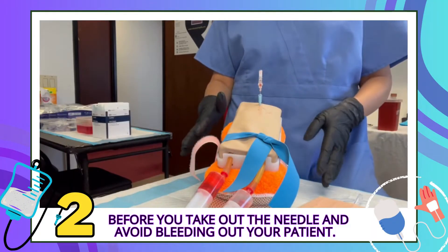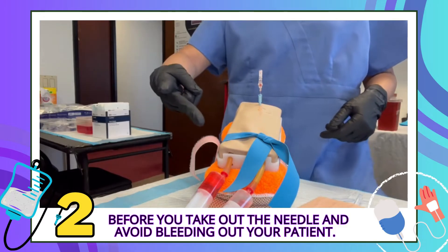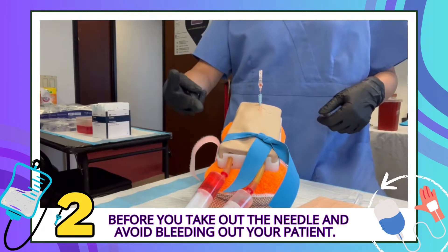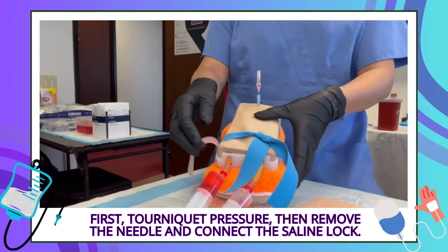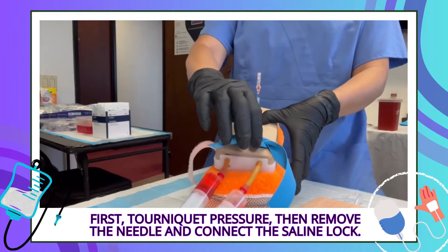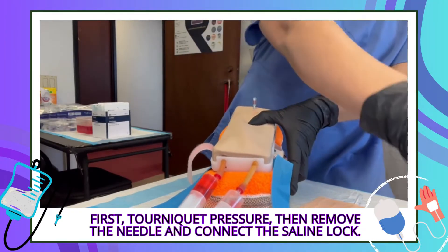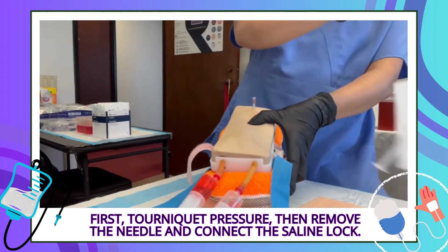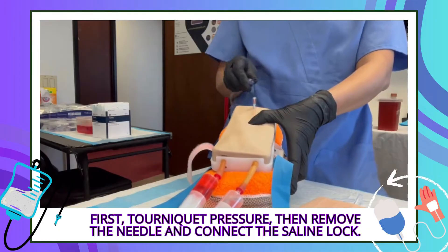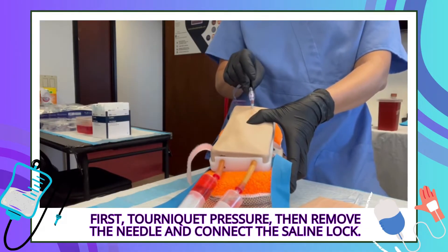Before we take out the needle, we got to do two things. What are the two important things so you don't bleed out your patient? Tourniquet and pressure — and then we can remove the needle. Do we leave it hanging? No, we got to connect your saline lock.